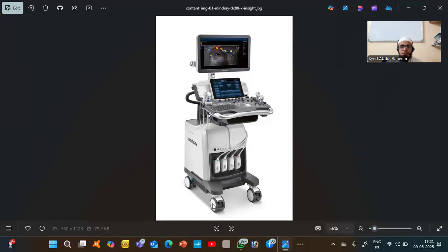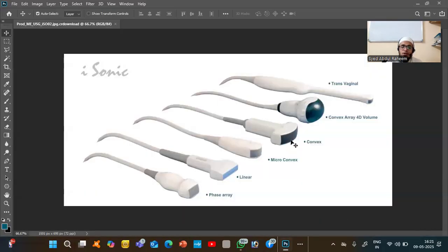So this is the probe. Probes have piezoelectricity, and it will generate the sound waves, and take the structure of internal organs, and again the sound waves convert into electricity, and the probe will catch that electricity. And the processing unit will display the image of internal organs.